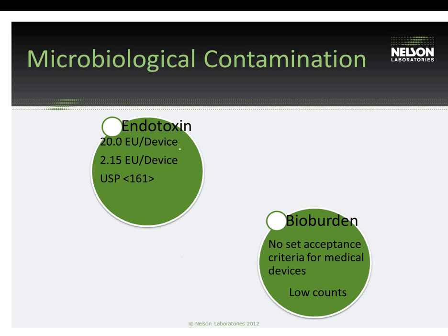If you include endotoxin testing as part of your validation, with that residue amount you quantified, maybe it also has passing endotoxin scores, and that can help you say that you have a clean device. Same with bioburden. However, there are no set acceptance criteria for medical devices.